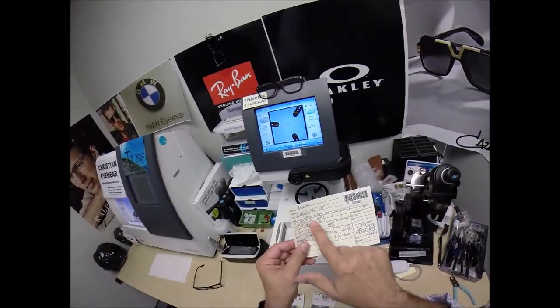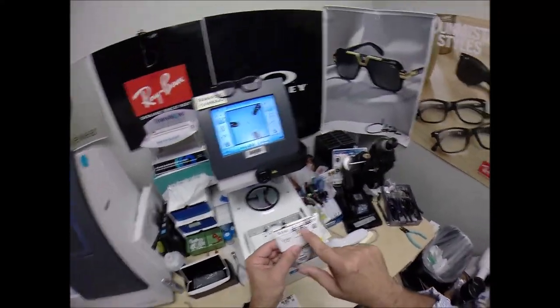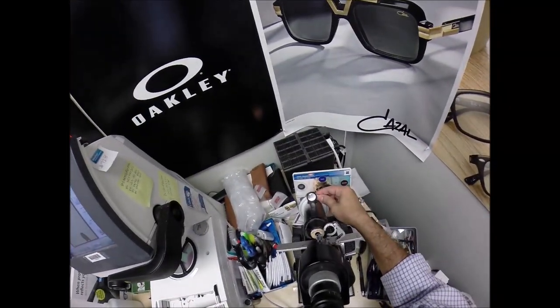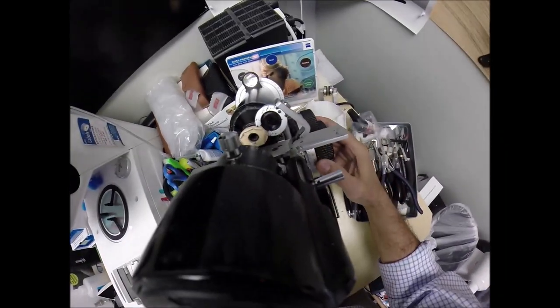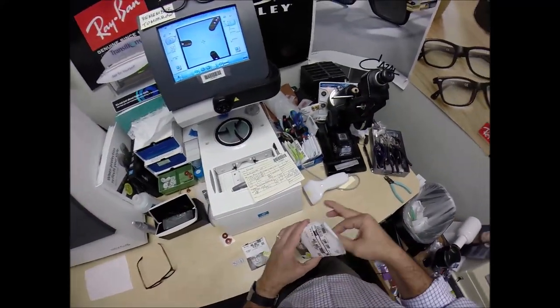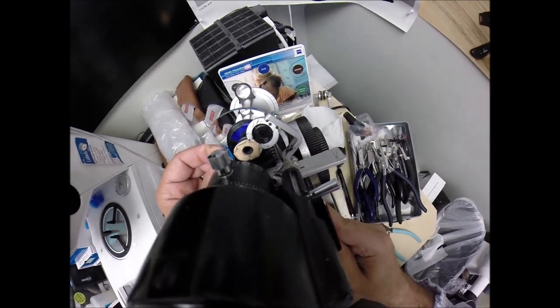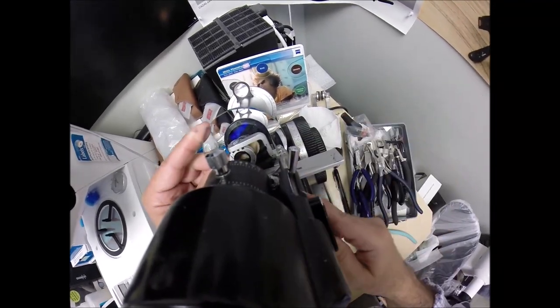Your right eye reads minus 5.50, minus 1 at 180. Let me make sure everything is on zero. Now I can put the power drum on minus 5.50. Take the lens out of the protective sleeve. Usually I rotate it to find the spherical component, but I nailed it dead on. Let me check your astigmatism correction.